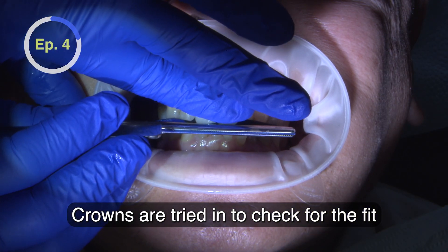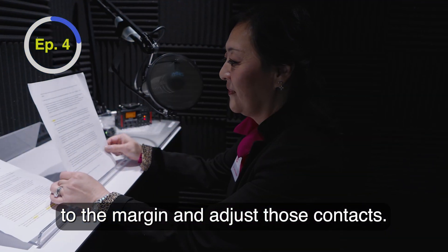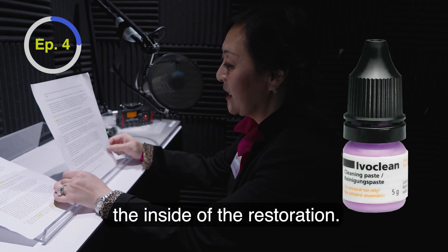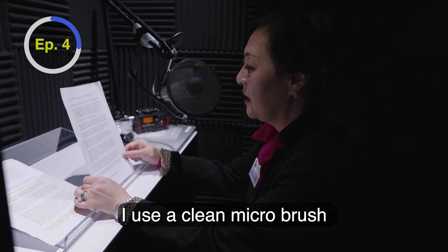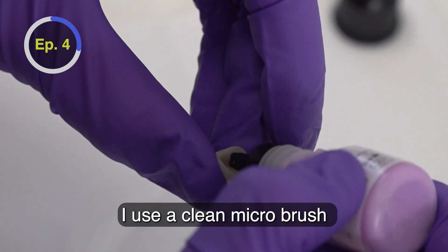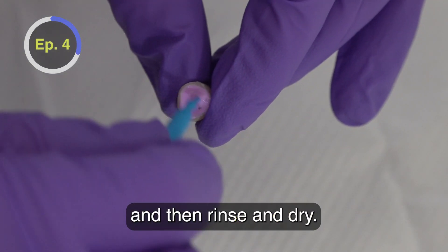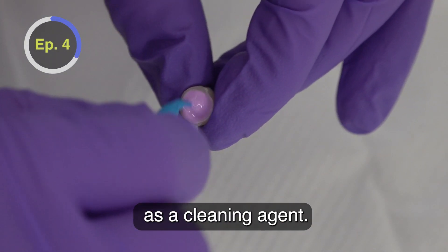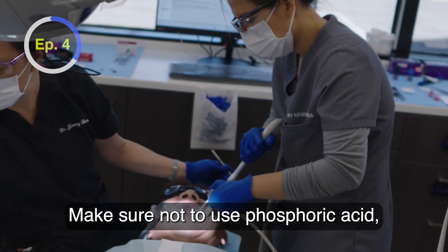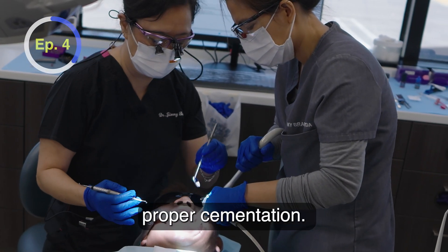Crowns are tried in to check for the fit to the margin and adjust contacts. IvoClean is used to clean the inside of the restoration to decontaminate. Use a clean microbrush and scrub the intaglio for about 20 seconds, then rinse and dry. You can even use 1–5% sodium hypochlorite as a cleaning agent. Make sure not to use phosphoric acid, which will interfere with proper cementation.